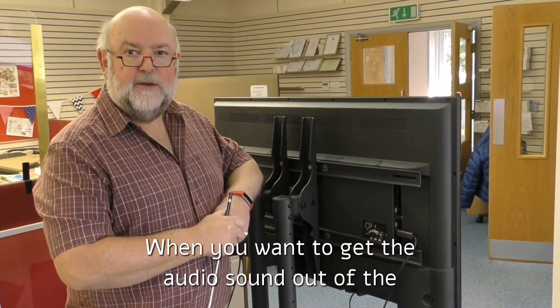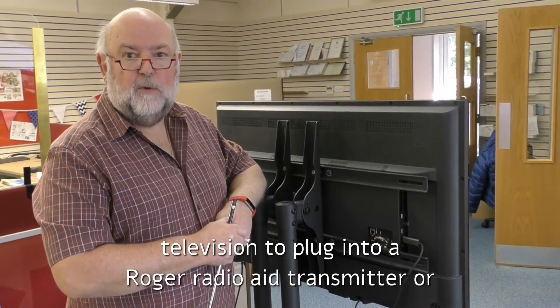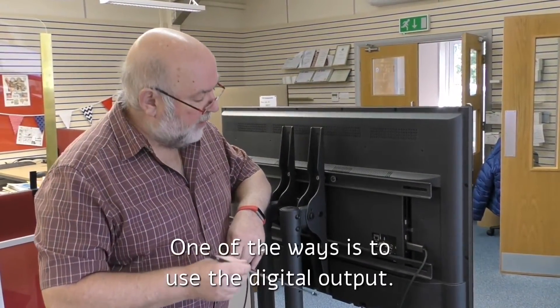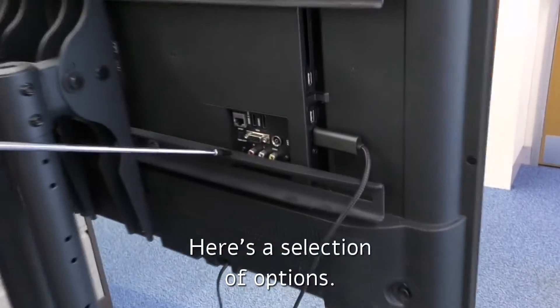When you want to get the audio sound out of a television to plug into a Roger Radio Aid transmitter, or perhaps a TV listener, there are lots of different ways you can do it. One of the ways is to use the digital output. Let's look a bit closer — here's a selection of options.